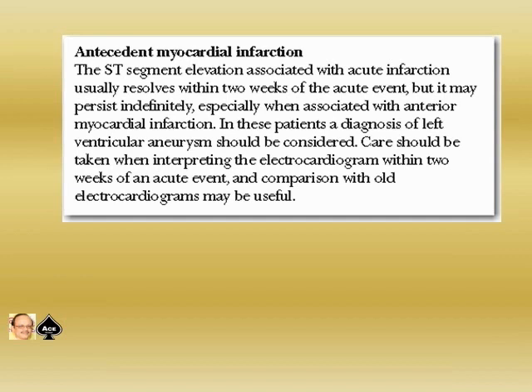So always tell the patients, when an ECG is taken, please keep the ECG. Cut the long strip into small ECG leads, paste them onto an A4 size paper and take a photostat, because the ECG recording will fade over a few weeks as it is not ink. Otherwise you may not get the old recordings.